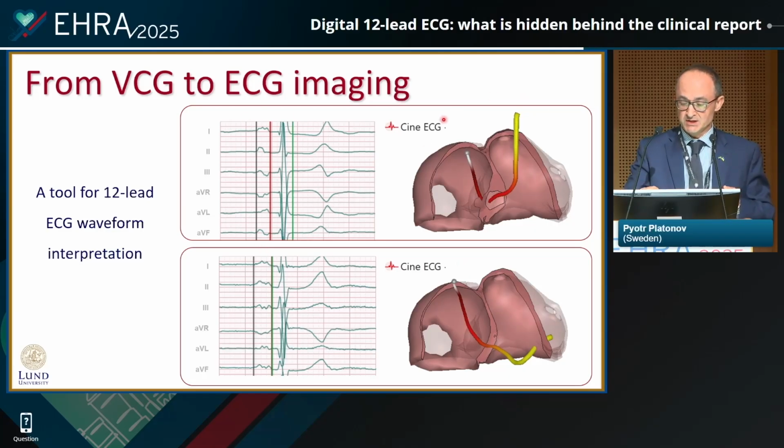But isn't it much easier to appreciate, looking at the curve that reflects the trajectory of the impulse propagation, when it first goes down, instead of crossing over to the left atrium over the Bachmann bundle, and it goes down there and then up again with the retrograde left atrial activation.